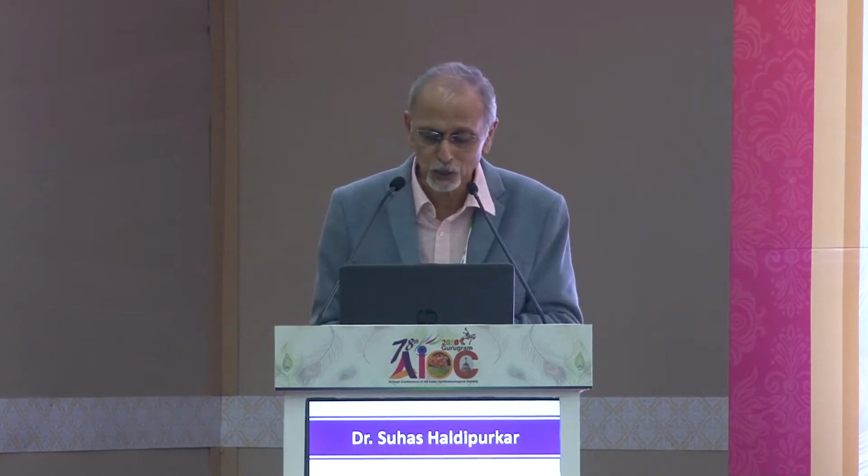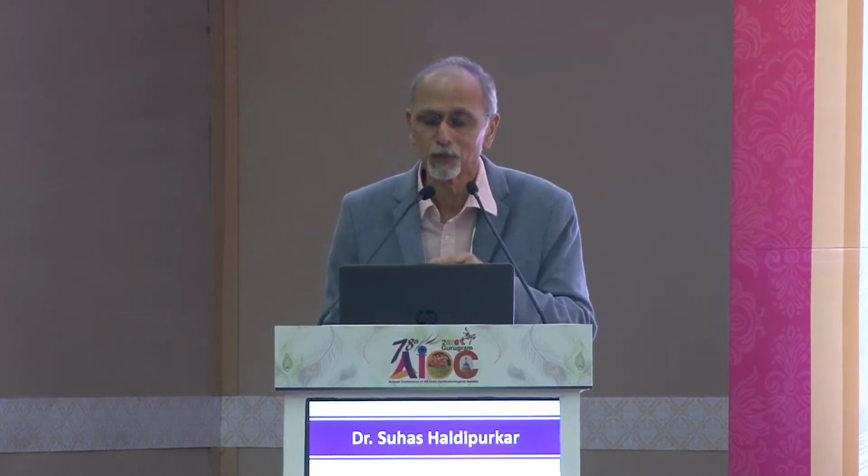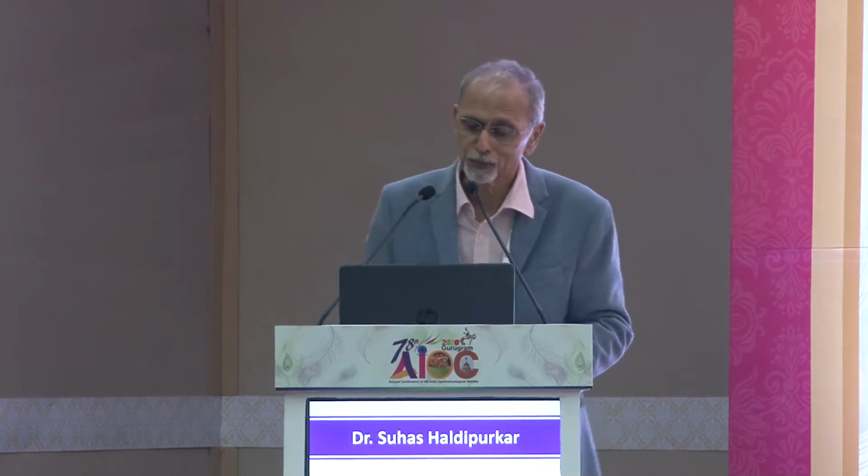And that decides what kind of further management you're planning to do, and the location of the defect will decide where you're going to sit, where your incision is going to be. The presence or absence of vitreous is going to be very important, because that way you'll keep changing your steps, whether you want to use dispersive viscoelastic or otherwise. When it comes to pre-op evaluation, there are subtle signs that you look for.